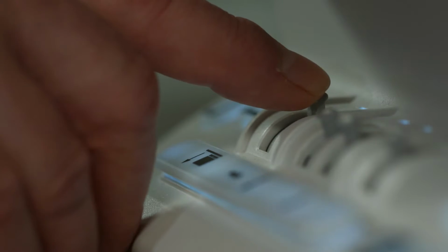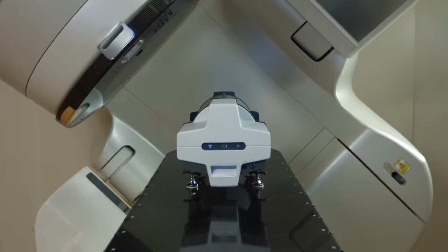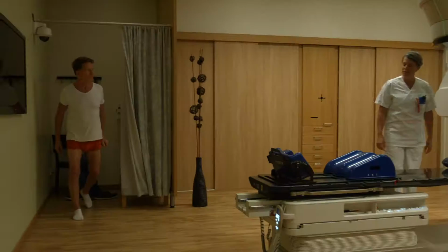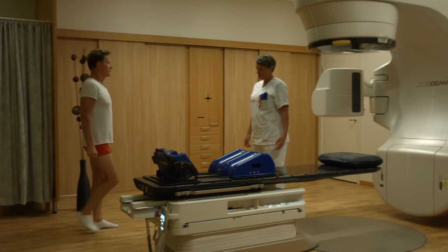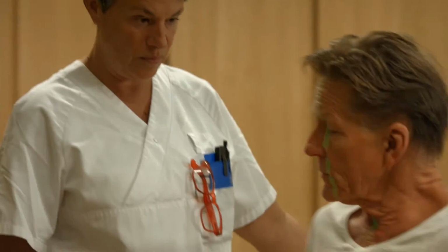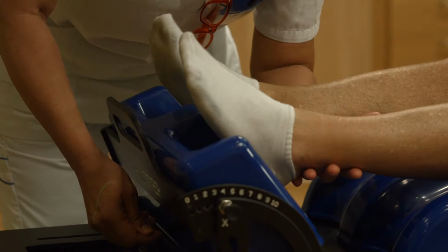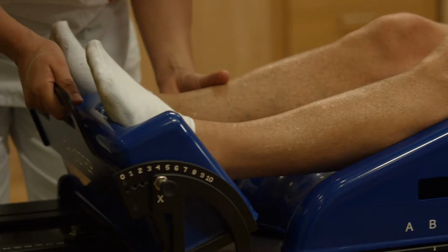Prior to the first irradiation, the physicist has already verified that the correct dose is delivered using a special measurement device called a phantom. At the first irradiation appointment, you will be positioned on the radiation table in the same position as you were during the planning and the CT. The irradiation position is carefully checked with X-rays or a CT, and after careful review, the first irradiation is performed.